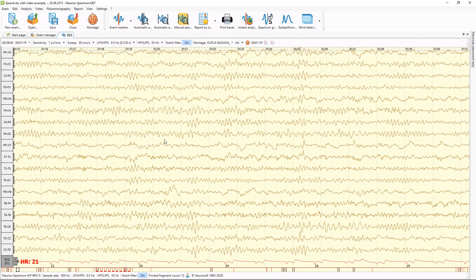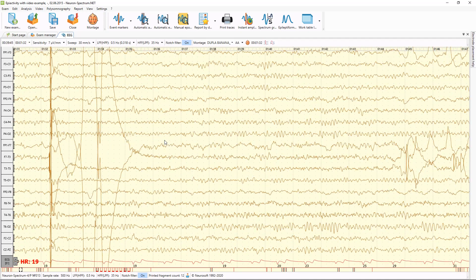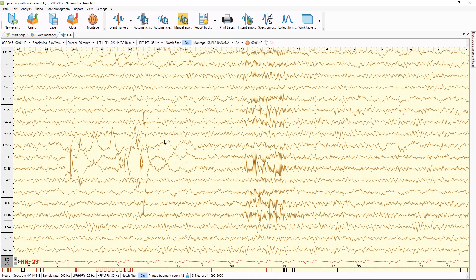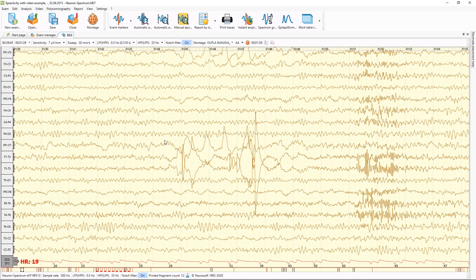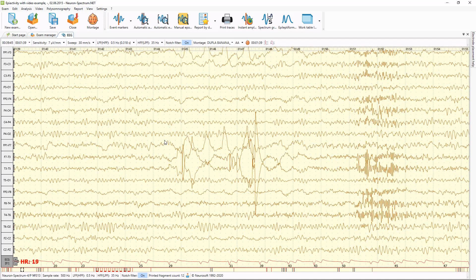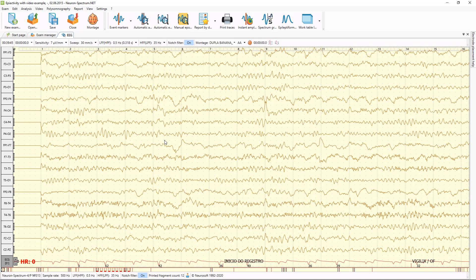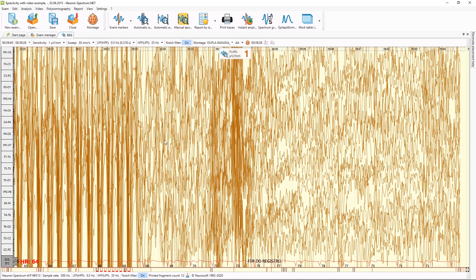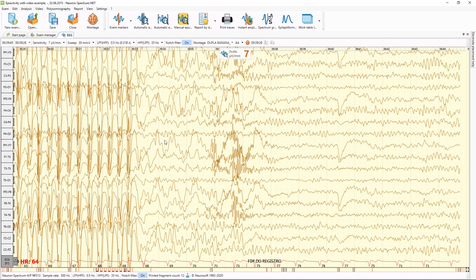For reviewing EEG traces, I can use the mouse wheel or arrow keys left and right, Page Up and Page Down keys for moving page by page to the left or to the right, and Home and End keys for navigation to the end and to the start of the examination.